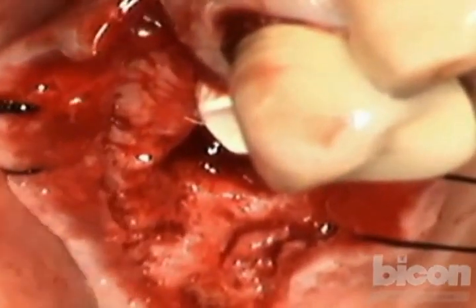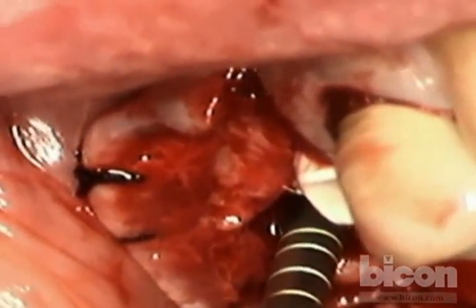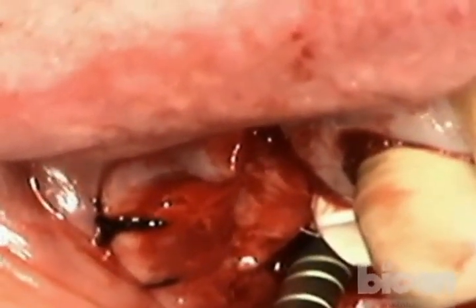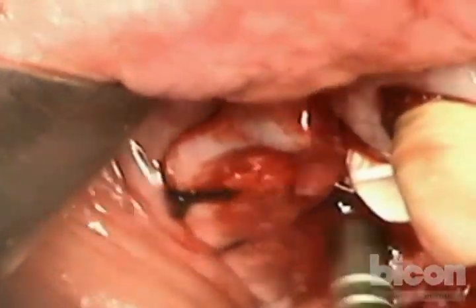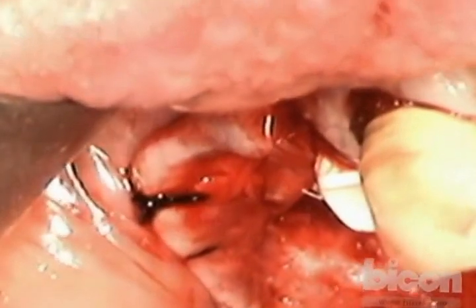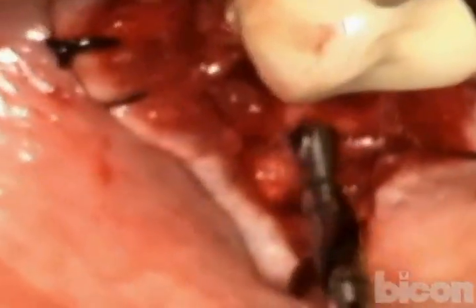All right. So here we are. And I'll aim more to the distal. Okay. And you can hear it when it's no longer resisting you. You hear that there is no resonance. It's sort of flatter. So now we'll go ahead and place our implants. I am using the pilot burr at a very slow speed still. And we're going to go right here.